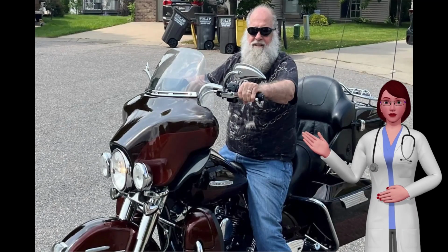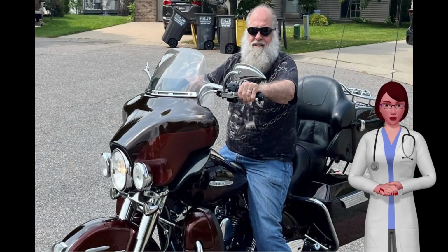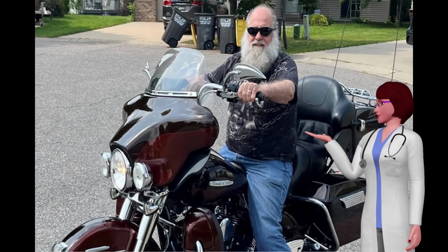The only criteria for patients who want to receive a smart knee is that they must be comfortable enough with the technology to be able to engage with the app, Dr. Ziegler says. The future of the technology is exciting to think about, he says. Future versions could have potential to detect micro-motions and subtle temperature changes to identify infection early on or loosening of the implant.